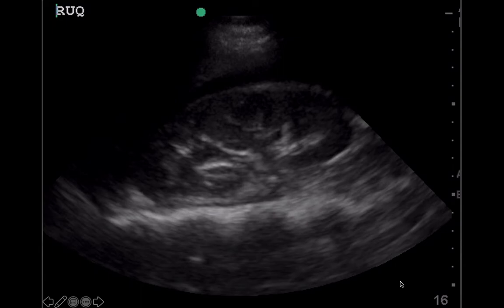So let's look at this normal right upper quadrant view here. We see the liver and the kidney easily viewed. You'll notice the diaphragm to the left side of the screen, and if your depth is increased slightly, you will also notice the spine sign at the bottom of the screen. The spine sign is a hyperechoic vertebral body's shadowing that continues to the level of the diaphragm in a normal patient.